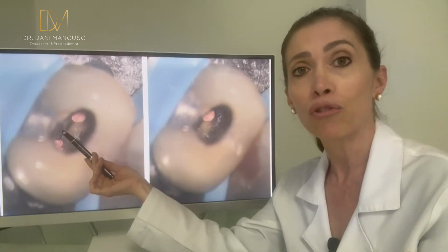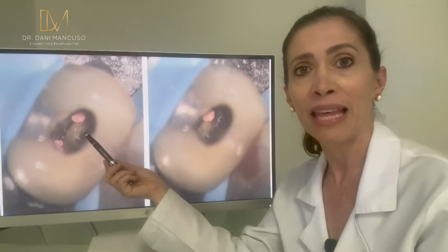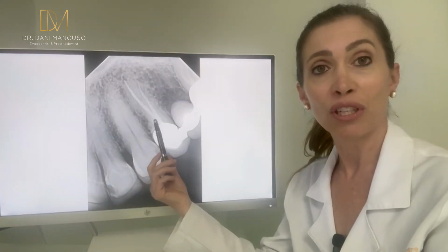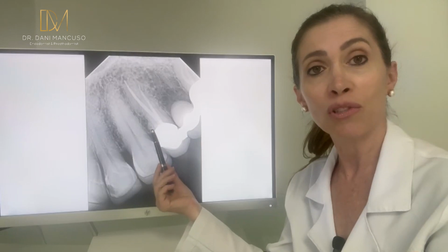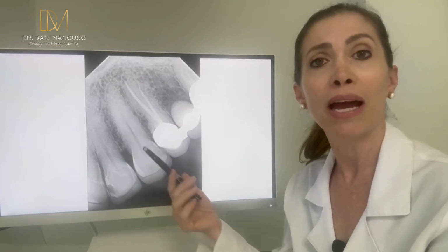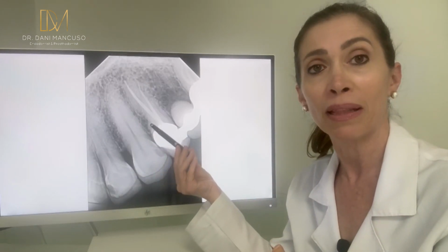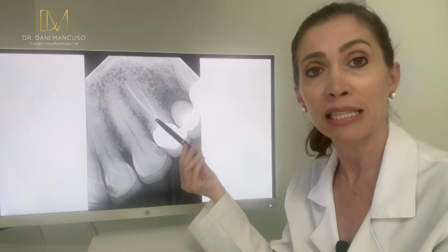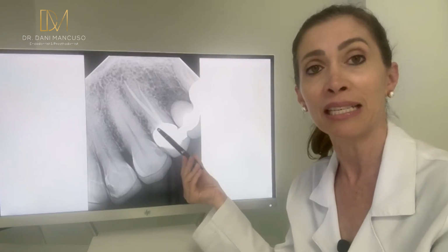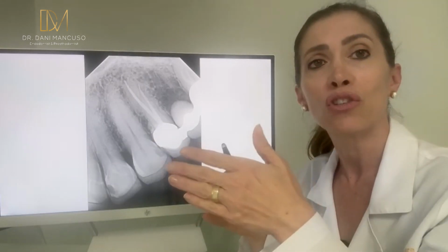So make sure you try to find some lines inside of the tooth. Those lines are your guidance. They will tell you that at the end of those lines there are probably those calcified canals. After the root canal treatment, that's now the result, and you can see that there is a little bit of composite here, but it's not going through, and that's where the deviation of the canal was. It won't be a problem because it was not too bad, but that was probably where the inclination started to go away from that metal. It started a little bit more mesially, and the dentist made a very small inclination, but that was enough to go off a bit.